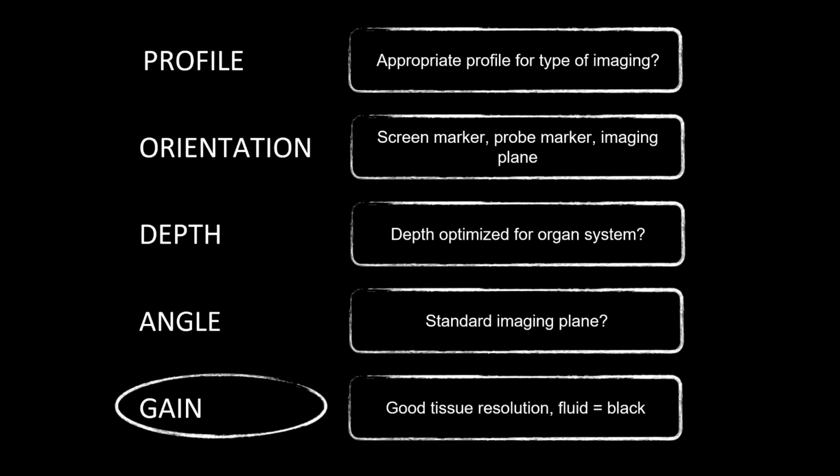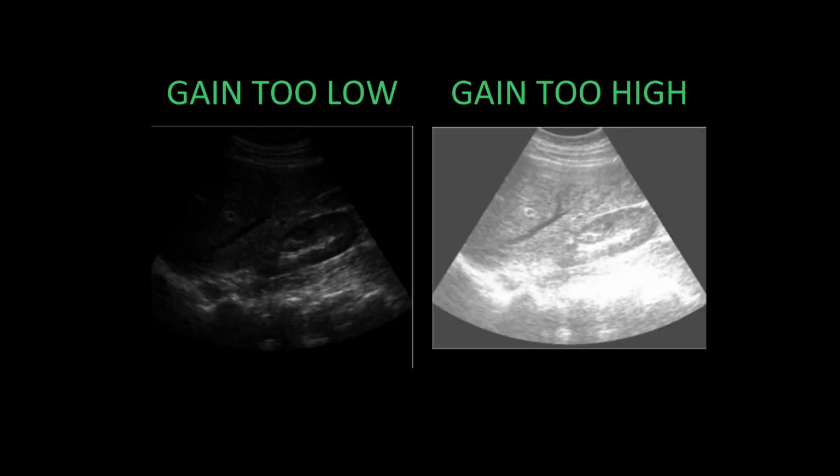Finally, we have to talk about gain and how to properly display on the screen the image that you're looking to get. The gain is essentially the volume of the signal. The ultrasound receives a specific amount of signal independent of any image manipulation performed on the screen in standard settings. The relative intensities of each region pulsed make up the gray mapping of the 2D image. All these intensities can be increased, keeping the relative differences between each of them. This makes the signal brighter or darker.